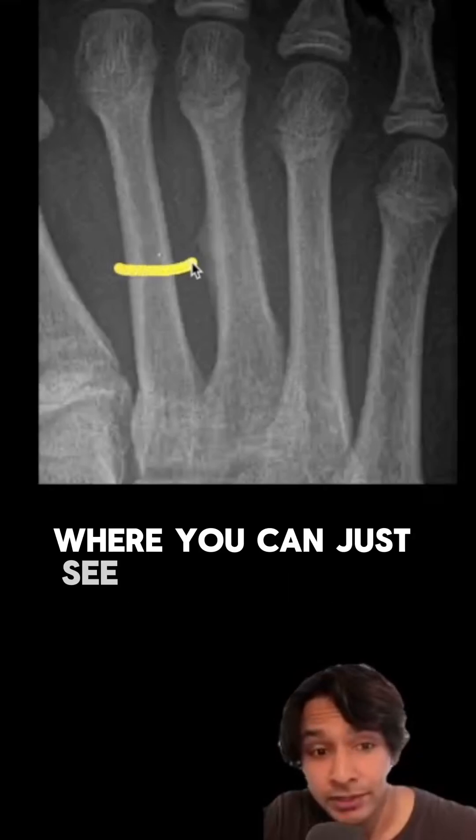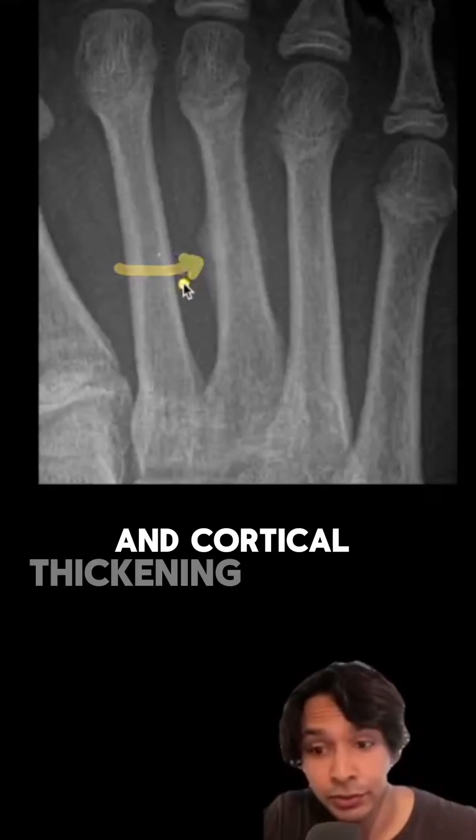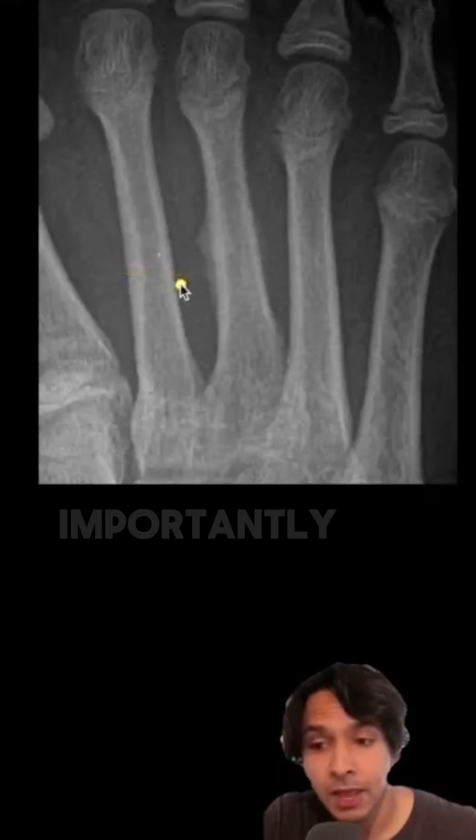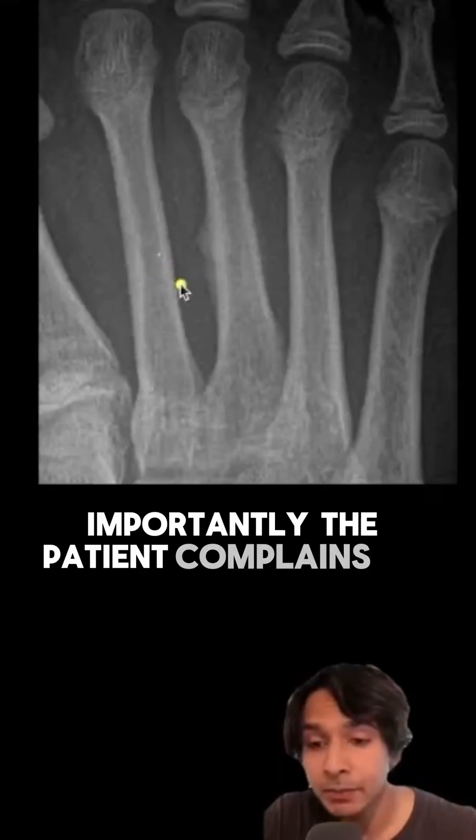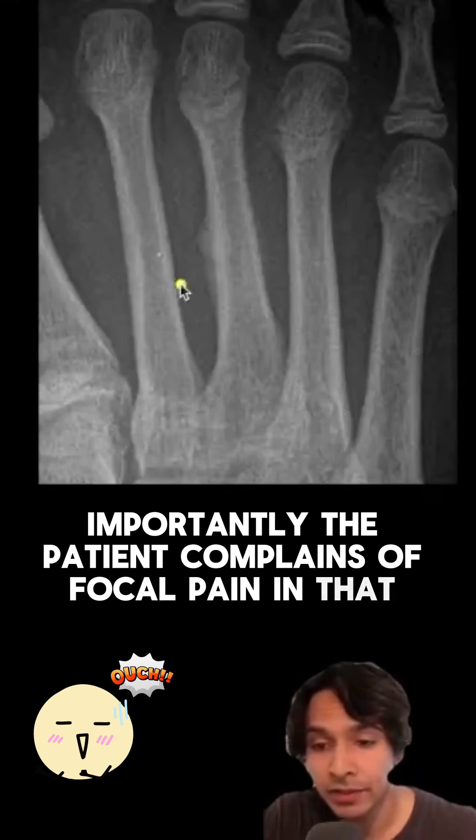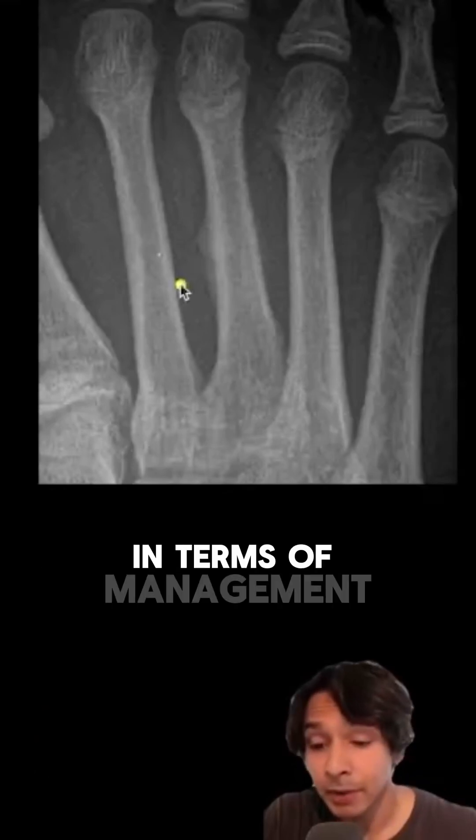Here's a more subtle fracture, where you can just see some increased sclerosis and cortical thickening along the site. Importantly, the patient complains of focal pain in that area.